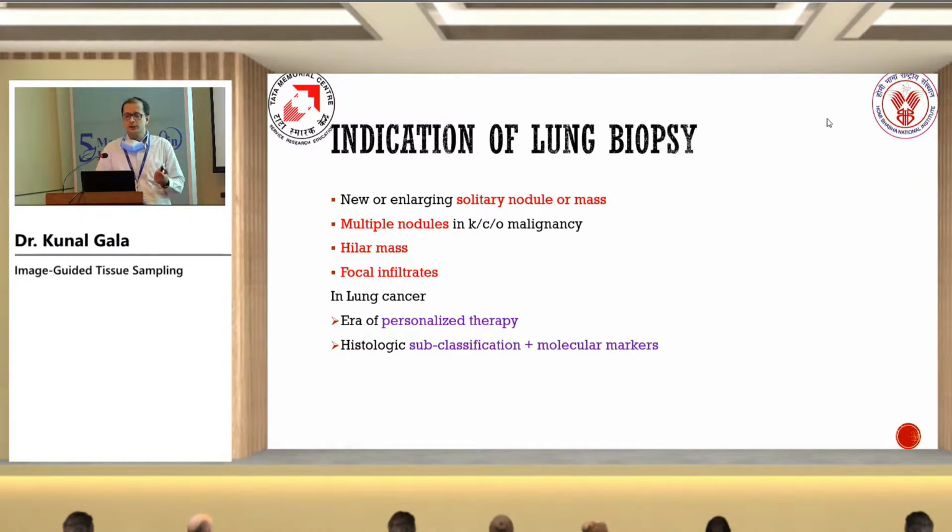Coming on to the indication of biopsy, why we need to do biopsy. So whenever there is a new lesion, when there is an enlarged solitary nodule or a mass, when the patient comes with multiple nodules, to characterize those lesions, in case of hilar masses and in case of focal infiltrates. So in case of focal infiltrates, either it could be malignant or benign, but TB being most common, we need to send for culture and sensitivity as well.